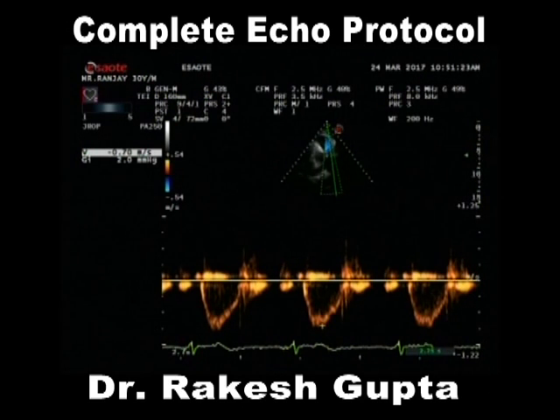It is 0.7. Do I need to convert to a continuous wave Doppler? No. We do not recommend that we convert to a continuous wave Doppler. By this, you will be able to avoid that one abnormality which I showed you by case demonstrations. And once you have looked at this pulmonic velocity, if turbulence is present or it aliases over here, obviously you switch over to a continuous wave Doppler to obtain the Doppler spectrum pattern and measure it.